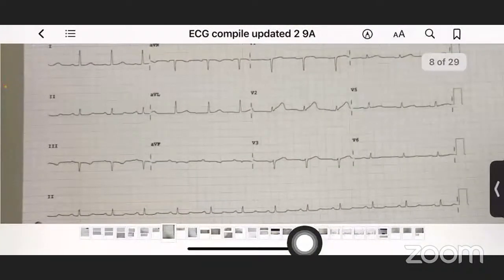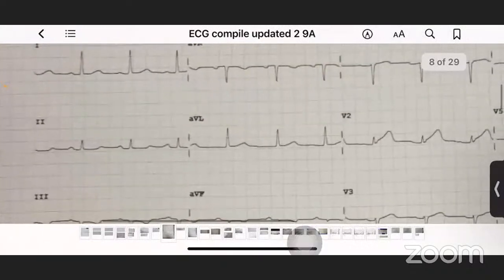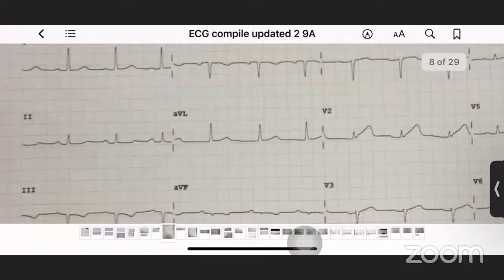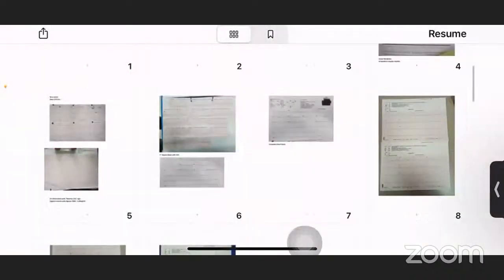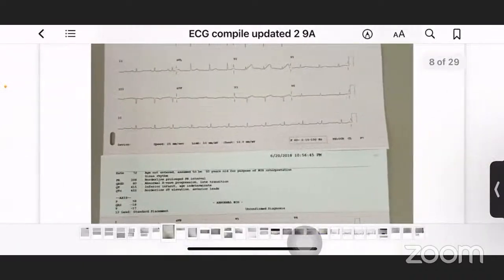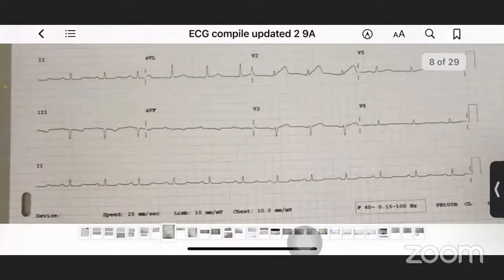First is always heart rate. What is the heart rate? 300 divided by 4. So what's the heart rate? 75, 70 something. So within normal, okay? And then it's quite regular. P wave seen? Yes, P wave is seen. Okay, what's the abnormality seen now?